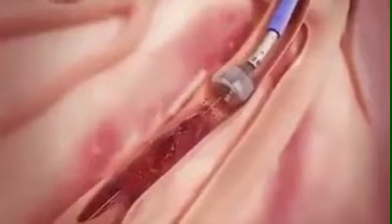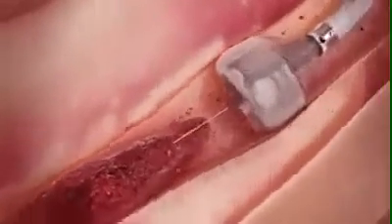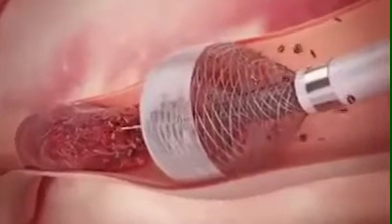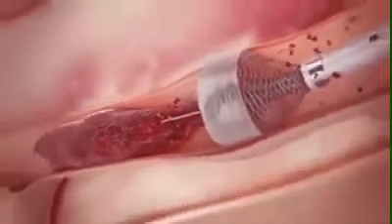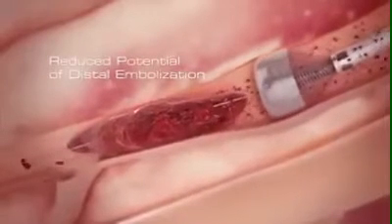The catheter is first positioned just proximal to the clot. The funnel mouth at the tip of the catheter is then deployed, occluding blood flow with its silicone elastomer on the distal aspect of the funnel. This results in the mouth of the funnel tip being maximally expanded in a radial fashion by the patient's own blood pressure, creating a seal against the arterial wall and arresting blood flow. Cessation of blood flow prevents clot fragments from traveling downstream, greatly reducing the potential for distal embolization.